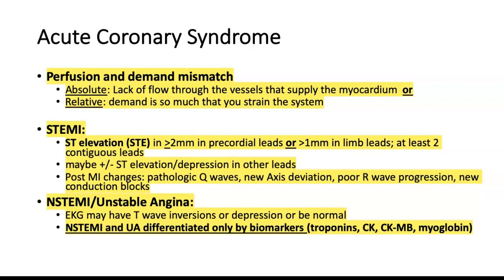So if you were running or doing some sort of cardiovascular exercise, or even if you were sick and your heart was trying to increase its rate, the heart may not be able to supply itself with adequate oxygen-rich blood because the vessels are too clogged or stenosed with cholesterol plaques. When this happens, there is a characteristic change in the EKG. The characteristic change we're referring to is ST segment elevation or depression.